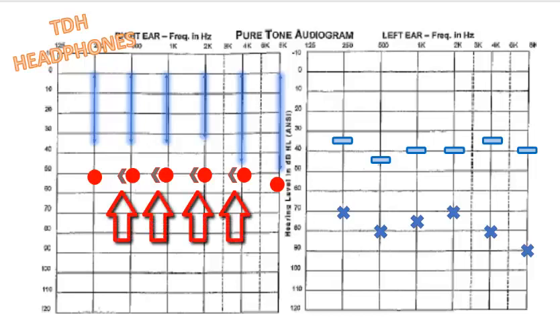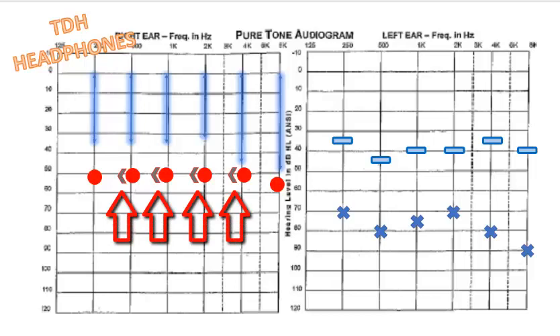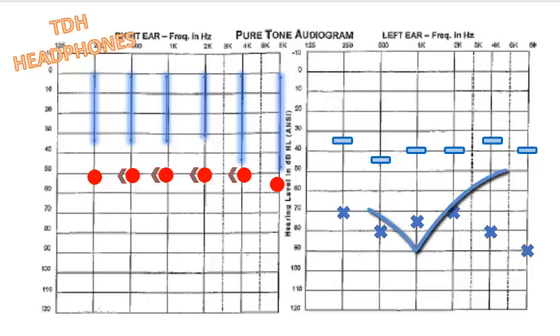Look at the bone conduction thresholds. Even with those high levels of crossed sound, the right ear will remain unaffected. So we'll have crossover but not cross hearing in this case. We don't make masking decisions on crossover alone. We must also consider the hearing status, that is, the cochlear hearing status of the opposite non-test ear. In this case, there's a significant sensorineural hearing loss in the right ear. So even with a high level of potential crossover, the right ear won't be able to hear it. Therefore, masking is not necessary. On the left side, we know we're testing the ear that we want to test.